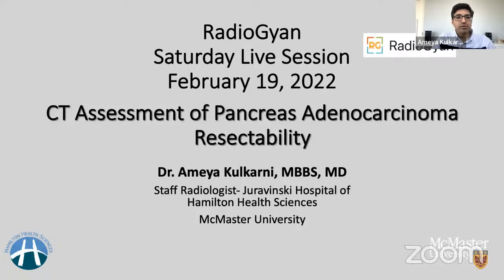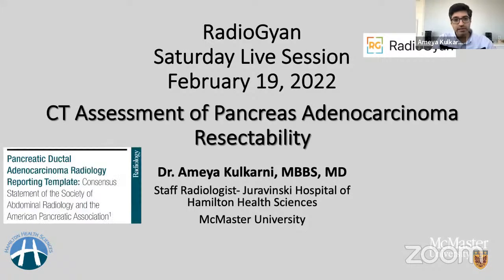So why did we choose today's topic of CT assessment of pancreas adenocarcinoma resectability on today's Saturday live session? Because this is one topic which I find is very valuable when you are providing patient care. If you're assessing patients with pancreas adenocarcinomas, there is a lot of literature out there, but the most important one, which you will find really useful in your day-to-day practice, is this paper from Radiology. It gives you a consensus statement of the Society of Abdominal Radiology and the American Pancreatic Association on developing certain key features to decide which pancreatic cancer is resectable and which is not.